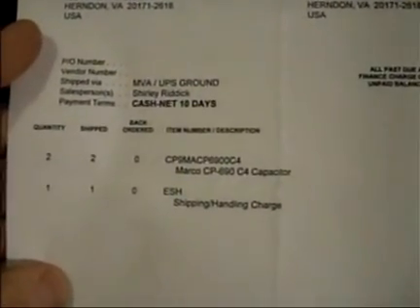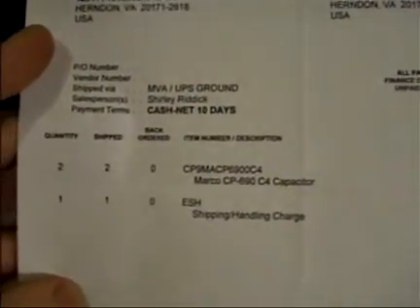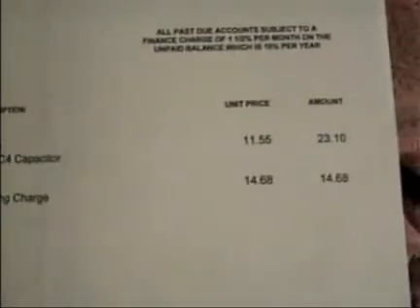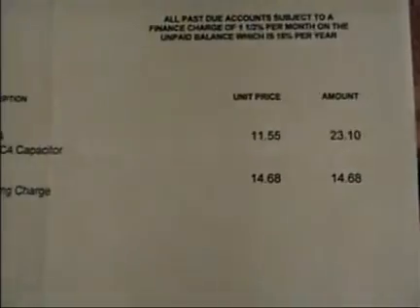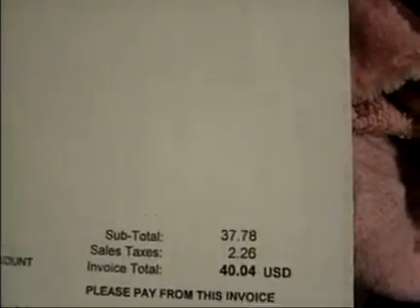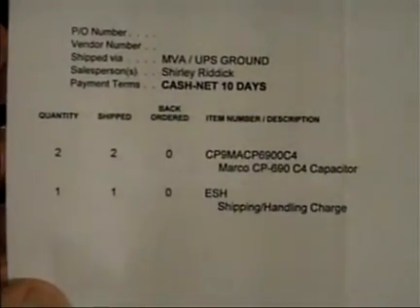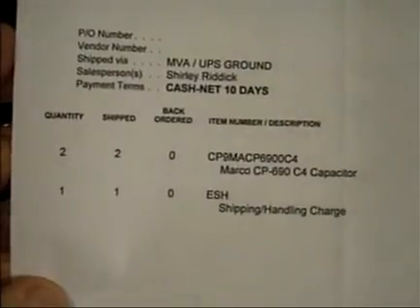This is from 2014 actually, slightly over two years ago. A previous projector had malfunctioned, and instead of ordering one of these items at about $12 plus shipping, I decided to order two. The spare capacitor then sat around for well over two years until the next projector malfunctioned. I pulled out the spare capacitor, brought the projector and capacitor to the medical maintenance person, he soldered it in place, and I picked it up a few days later. The chart is once again functional.